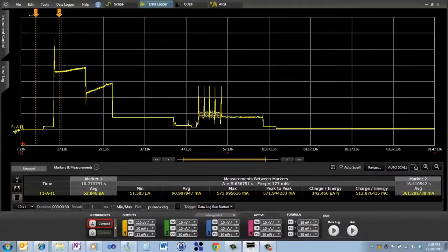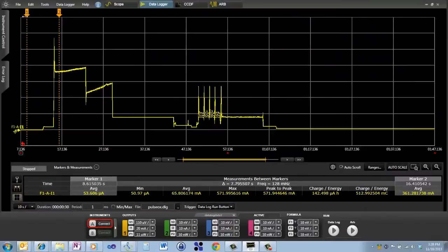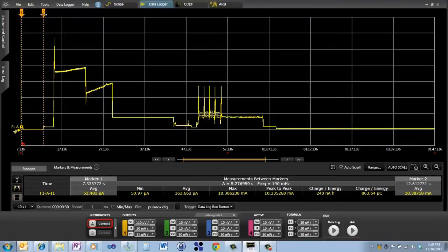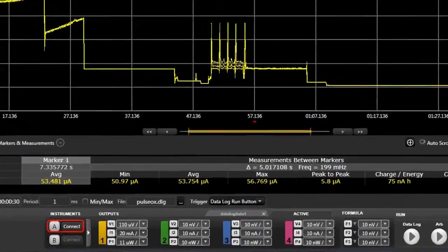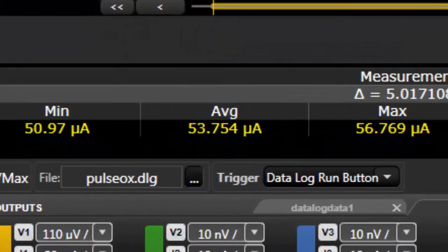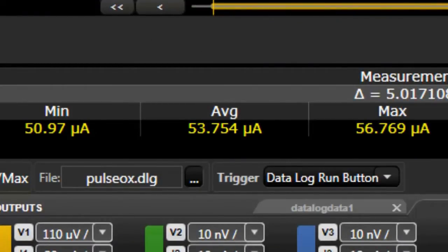We can also use these markers and I'm going to move to the sleep mode when the device was sleeping. And here we can see that the average is 53 microamps. But the minimum and the maximum are only 5.8 microamps peak to peak.